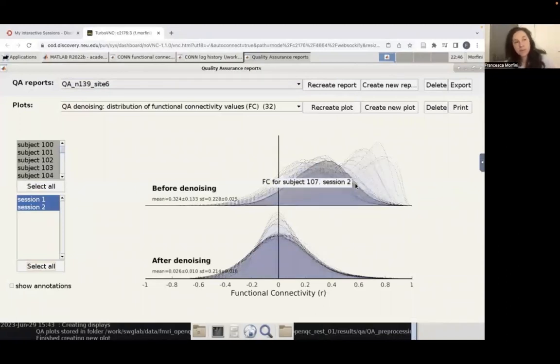For example, residual bias tends to shift the entire functional FC distribution towards stronger and positive values. So there are very few that are negative. It biases the center of the distribution, but it also modifies the shape in a manner that is highly variable across runs, and again severely skewed towards positive values.